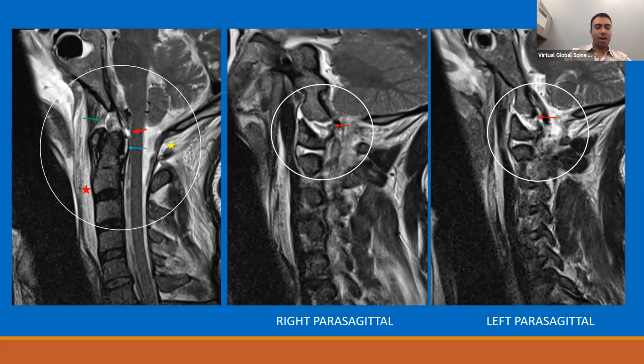Although this is very dangerous to his neuraxis, it's not immediately life-threatening. If he has some other abdominal injury that's very dangerous, that can complicate things. So yeah, Ali, I'm just wondering what you're thinking.